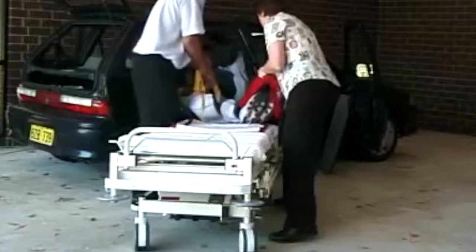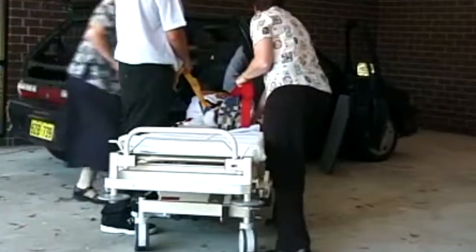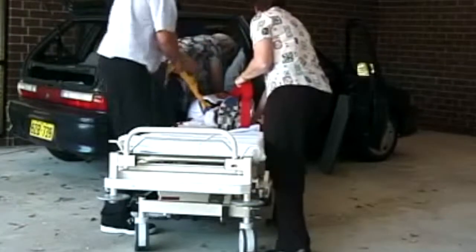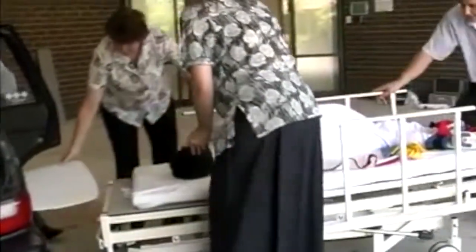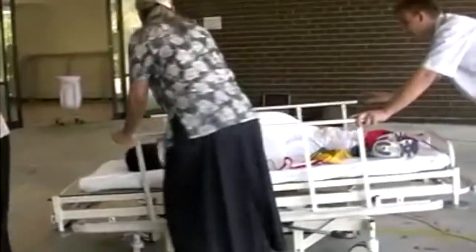As the patient's chest is pulled to the car door, the carer in charge tells the pullers to stop. They then go around to the other side of the car to look after the patient for the final pull to slide the patient fully onto the trolley. Here is a view from inside the car taking the patient out onto the trolley — a very low risk way for carers to remove the patient from the vehicle.